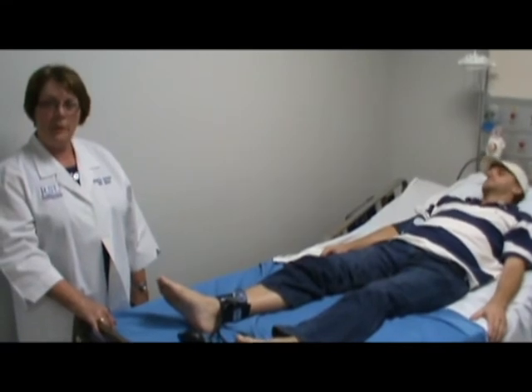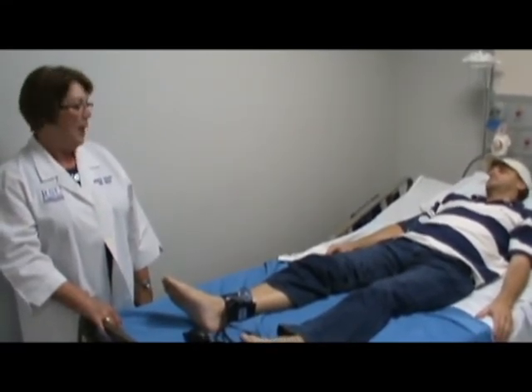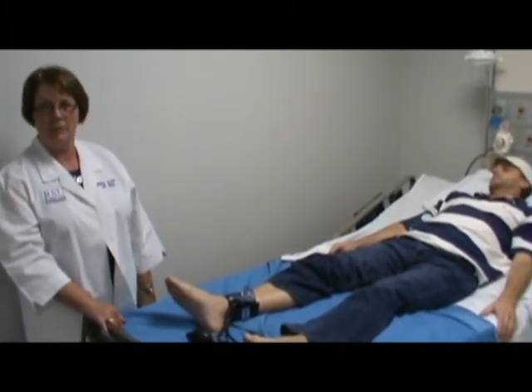Remember, it's always important for the professional nurse to introduce themselves to the patient and to explain the procedure, answer any questions before you begin.